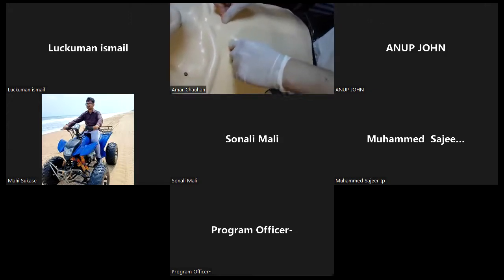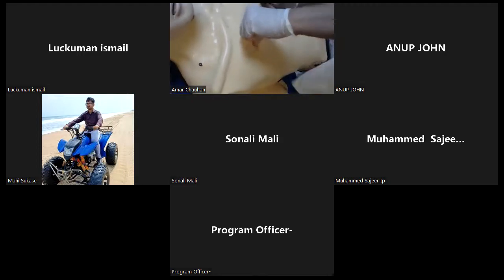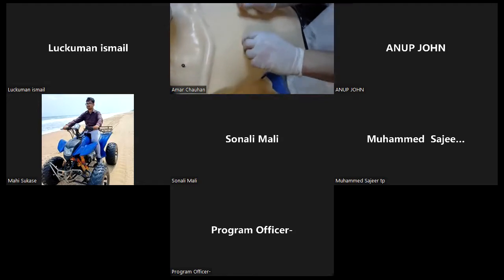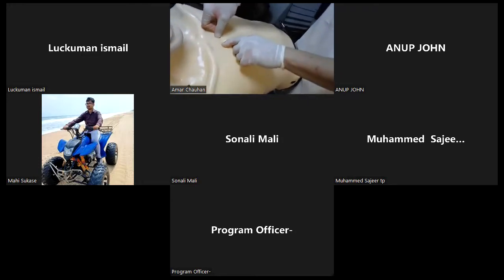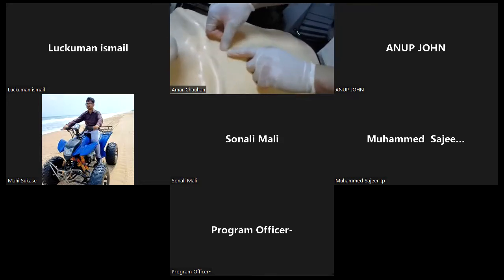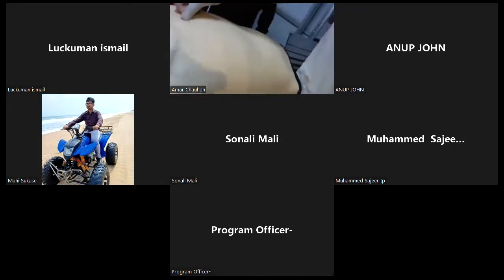Then you count downward: the second, then the third. This is the third rib, like my thumb going inside, like in the patient. This is the fourth rib, then this is the fourth space. The space is below the ribs. So this is the sternal angle. You will have to feel it. It is not that prominent, but I will try to make it more prominent. This is how to count the site for needle decompression.